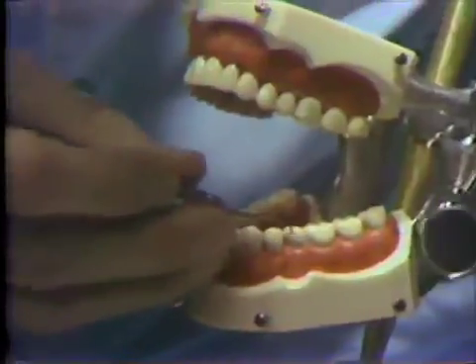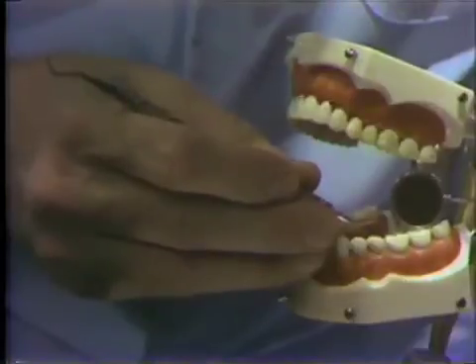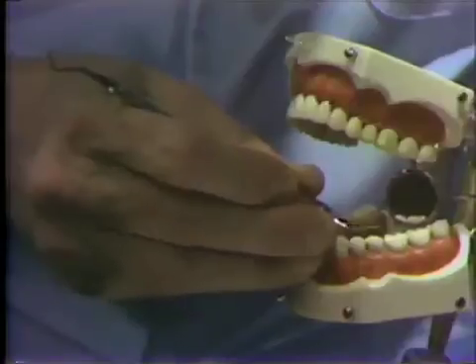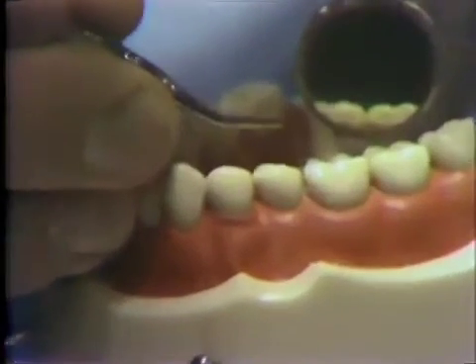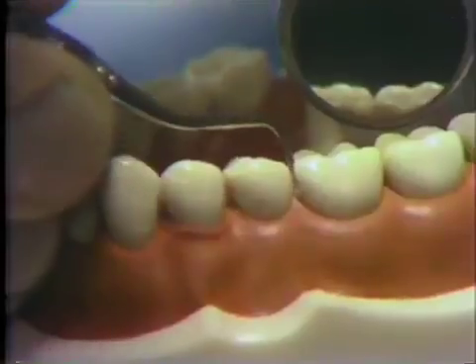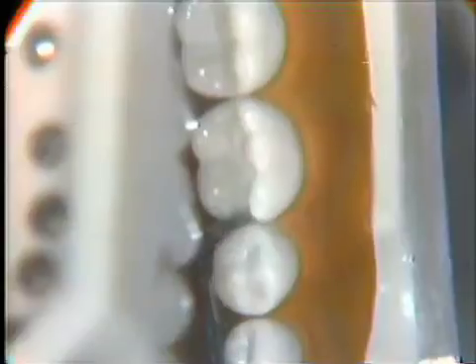To refine the proximal box of a Class II amalgam preparation on tooth 19, which has been roughed out but not finished, we would apply the H1, H2 type enamel hatchet to the proximal wall. The planing action would be essentially directed toward the cervical, developing a rounded buccal proximal cervical angle, and extending across the cervical floor, smoothing the floor, and sharpening the internal line angles — the buccal proximal axial cervical line angles.